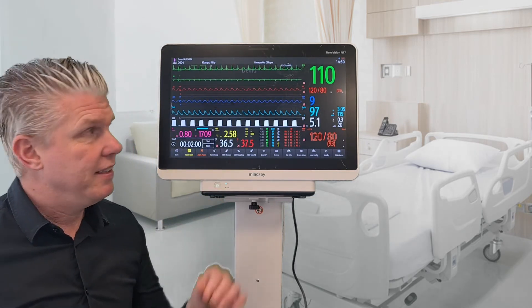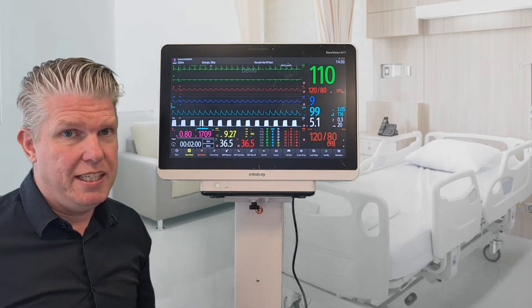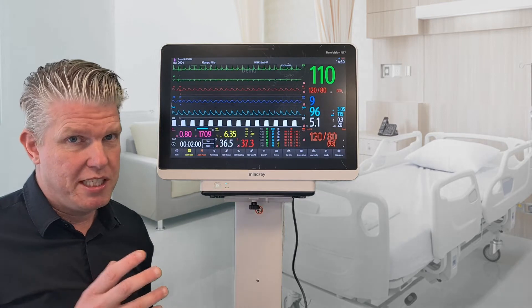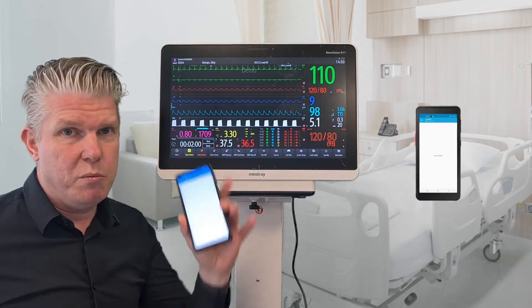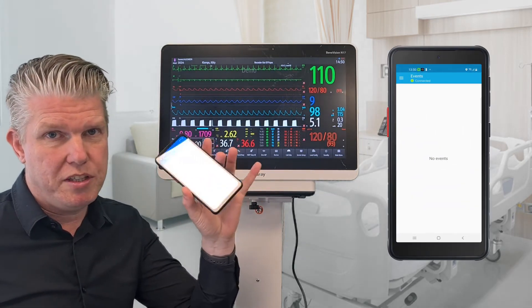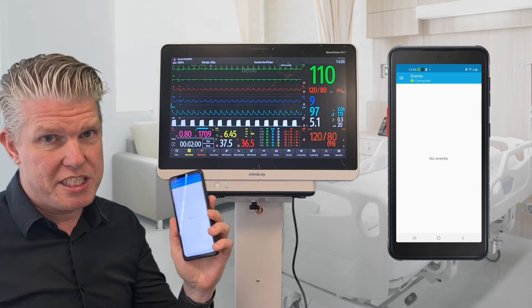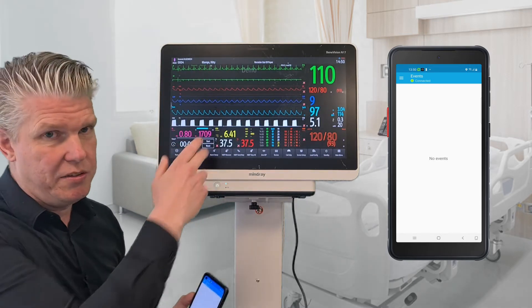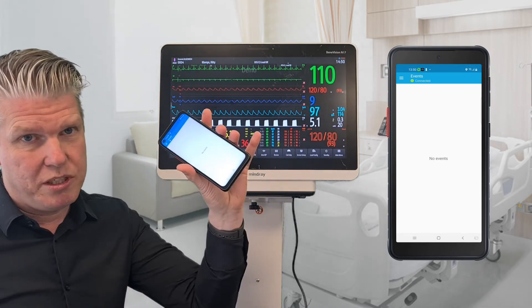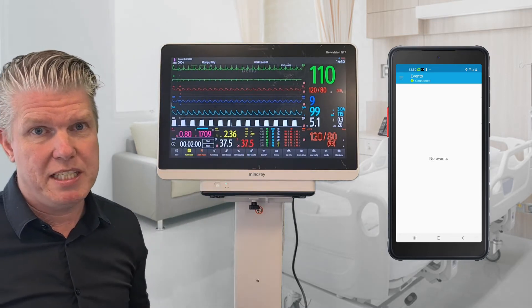When I create an alarm, the same sound you hear on the machine will be received on the smart app. So it will be the same sound. If I turn off the sound, you can also still hear it on my smart app.